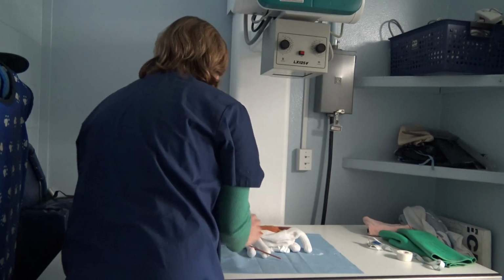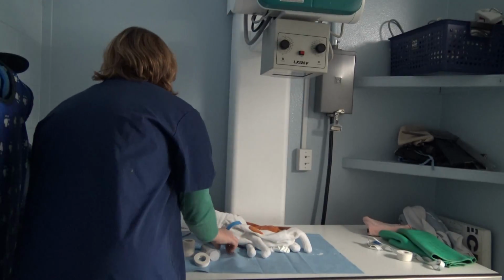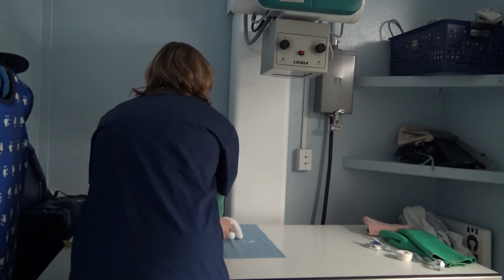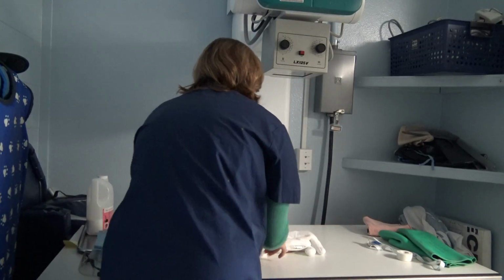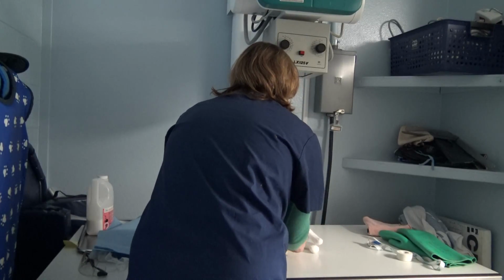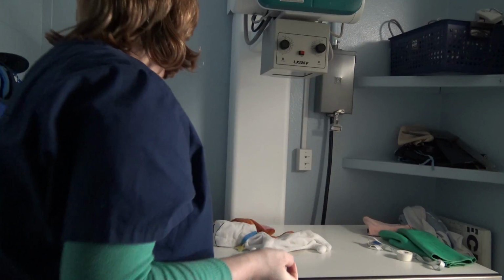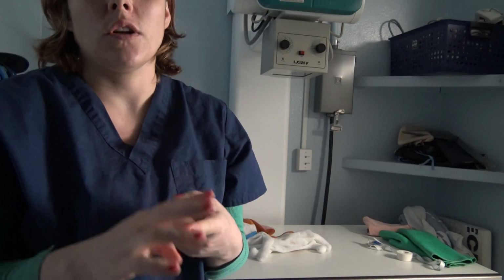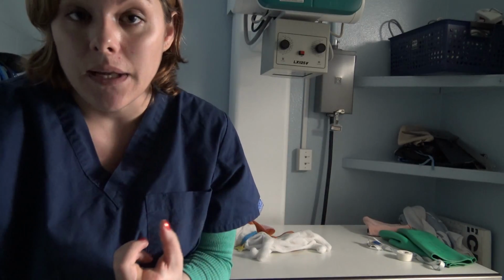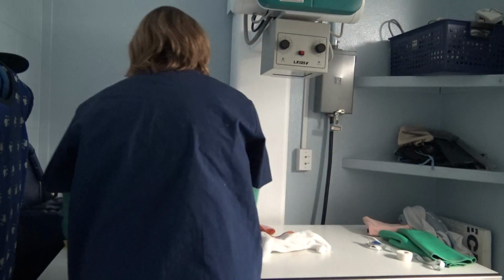So now that we got the barium in our patient here, we would move him to our x-ray table. And again, since it's a busy hospital and I'm trying not to take up much room, we're already at the x-ray table. So I'll move our drape. And again, we're going to go ahead and repeat the lateral x-ray that we just did in the same technique. You're going to do the lateral x-ray and you're going to do the repeat x-rays in theory at 15 minutes, 30 minutes, 60 minutes, and then every hour until it reaches the colon. So we'll go ahead and reposition our patient.